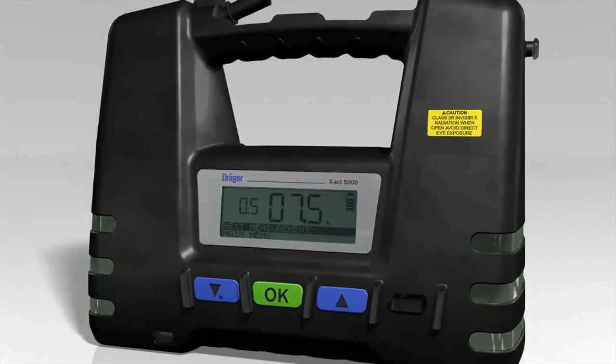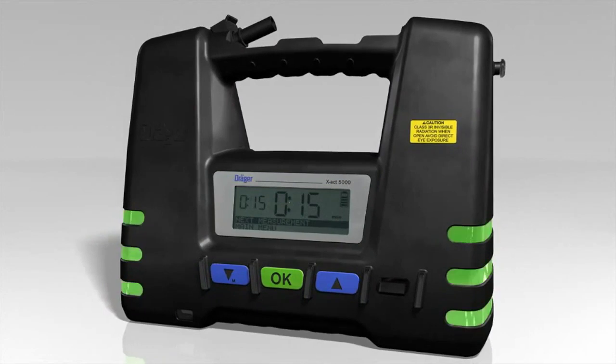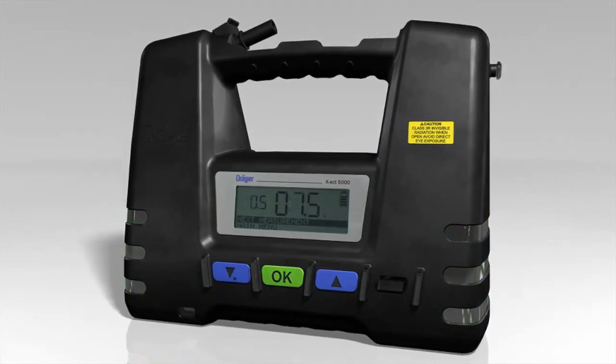When sampling is complete, the LEDs flash green. Finish sampling by pressing the OK button. You can then take another sample or return to the main menu.